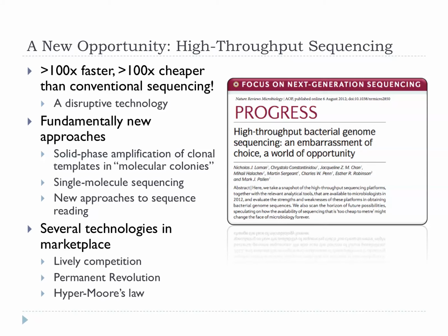Boyer and Cohen went a long way with their recombinant DNA technologies, but now with this technology we're actually abandoning having to replicate DNA in plasmids in E. coli. Everything's now done as chemistry, and we have these clonal templates, molecular colonies if you like. We've actually just published in Nature Reviews Microbiology a review, so if you're interested in anything I'm saying, I'm not going to go a lot into the technology here. If you are interested, then go and look at the review that's just come out.